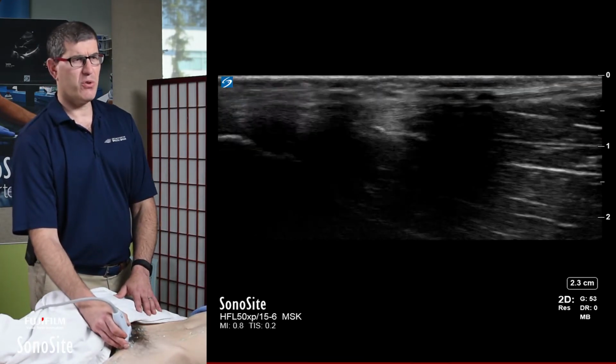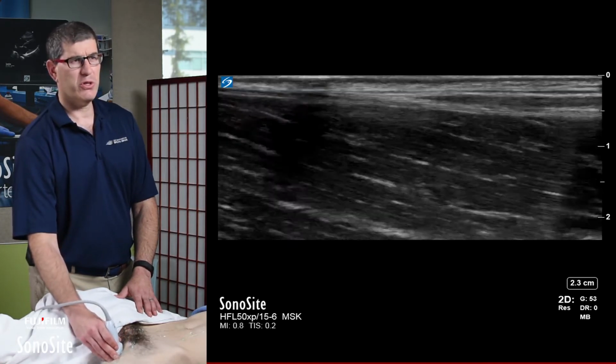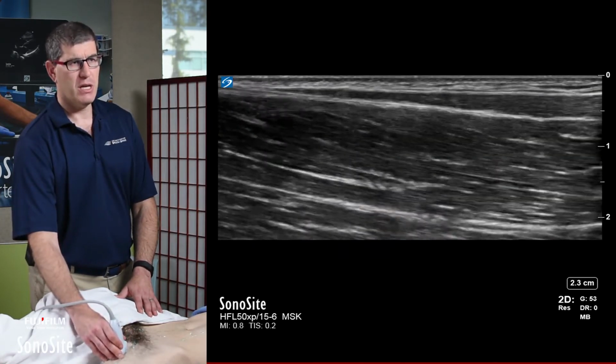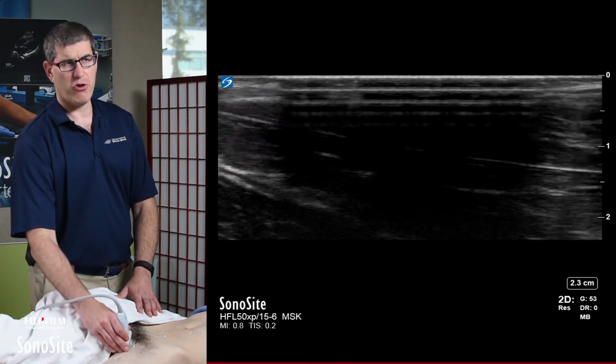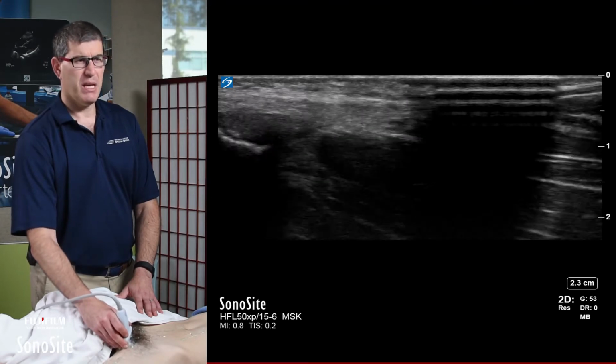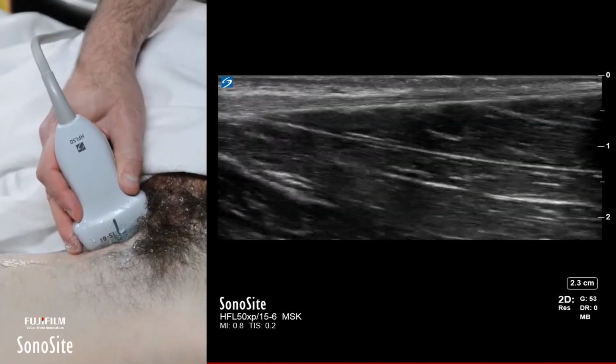So the most distal variant that we commonly see, and usually muscles do okay, although you can certainly see a hematoma formation in the muscle. But most commonly when you're going to get an injury of the sports hernia complex, it's going to be in the myotendinous junction of the groin musculature. So let's get a view there.